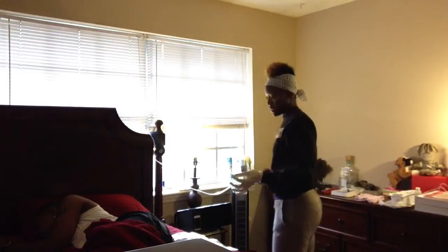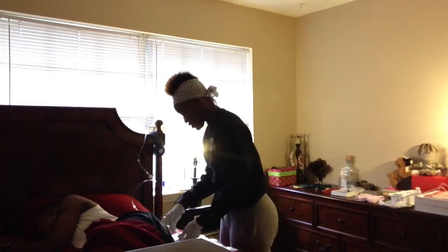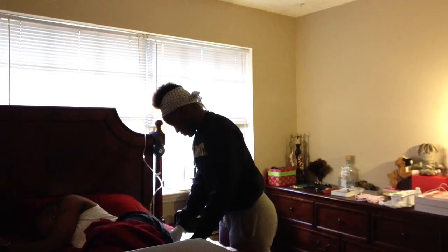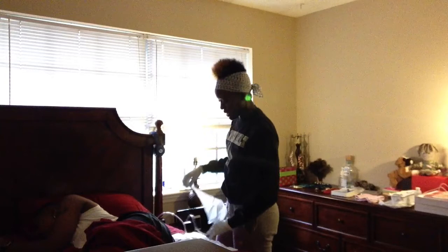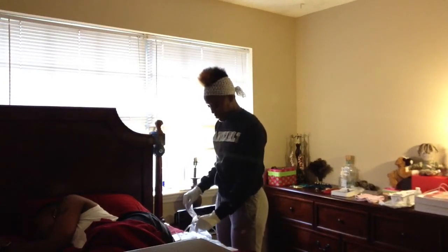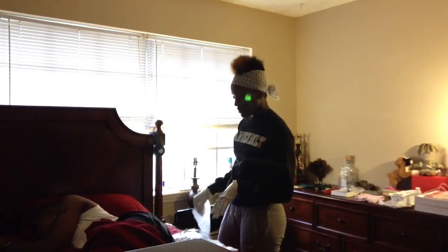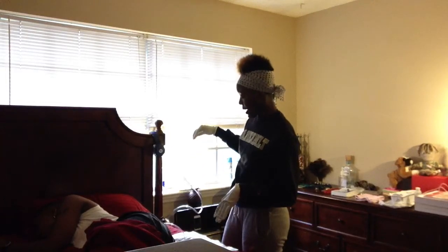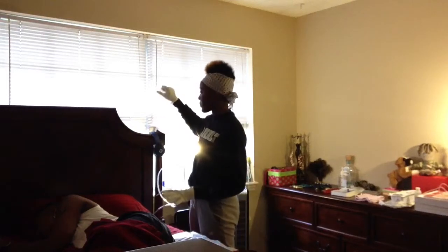I'm going to remove the cap and I'm going to generously lubricate the enema. Once it's lubricated, I'm going to gently insert the enema. Once I have it inserted, I'm going to take the bag, put it at hip level, and remove the clamp. As the enema starts to flow, I'm going to see Sophia's tolerance for the enema. I'm going to gradually raise the bag 12 to 18 inches, as long as Sophia tolerates that pretty well.